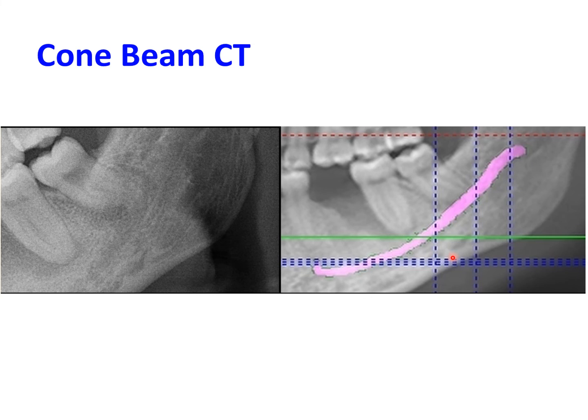Now just a couple of words on the value of cone beam CT. Obviously it sounds posh and commercially it might be a selling point for many practices if they offer a cone beam CT. But a recent systematic review shows that in most cases when cone beam CT scans are taken, it does not seem to influence the treatment plan for the impacted third molar.